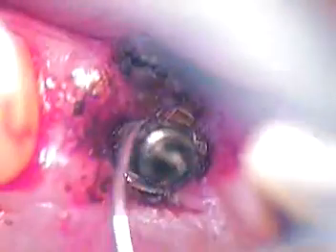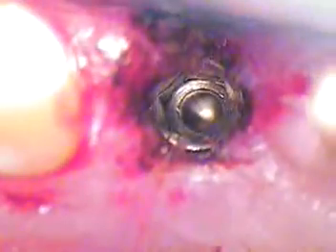Okay. Looking for a serial number. Can't see. I think now they probably popped the number down on the base of the implant. But I think back then they were all so into design. You knew it was a certain design, a certain type of implant. I'm just verifying that we got nothing on the corners. Good. Perfect. Okay, so at this point we're ready to try in.